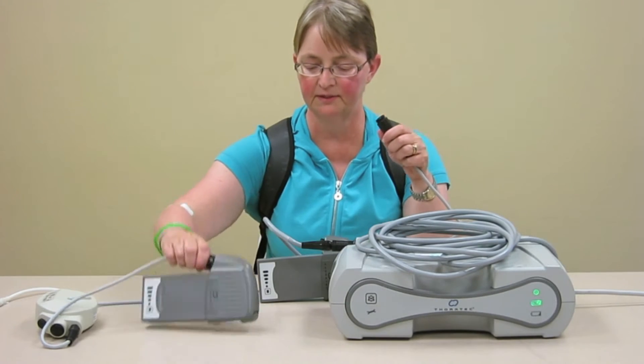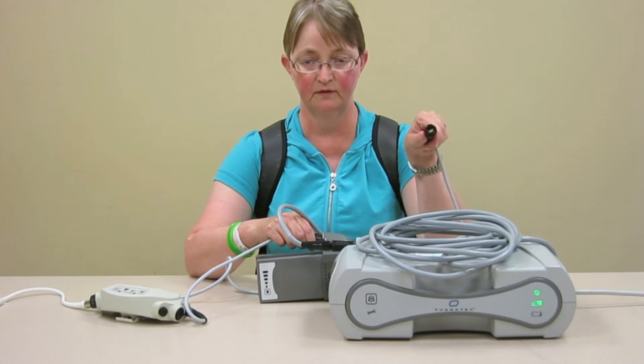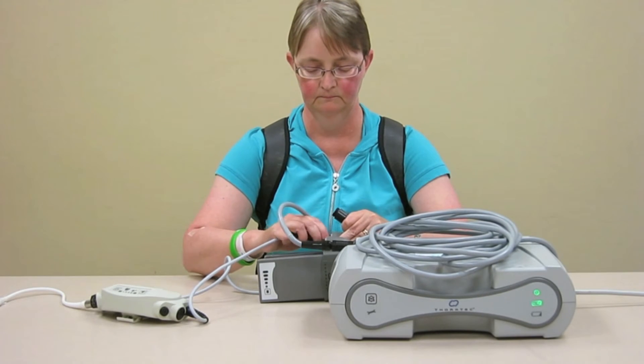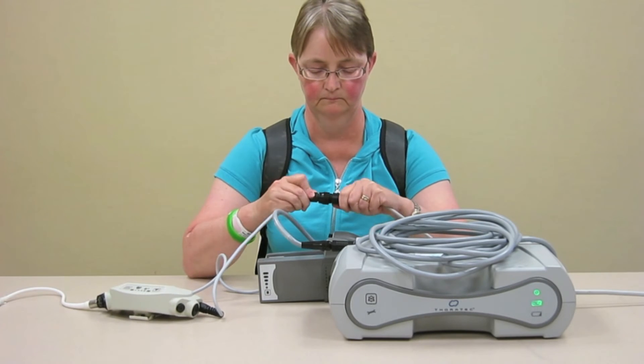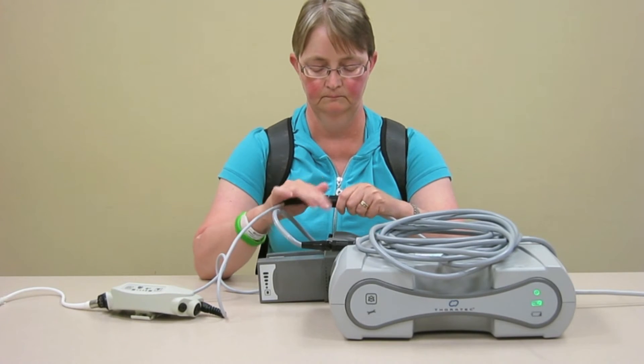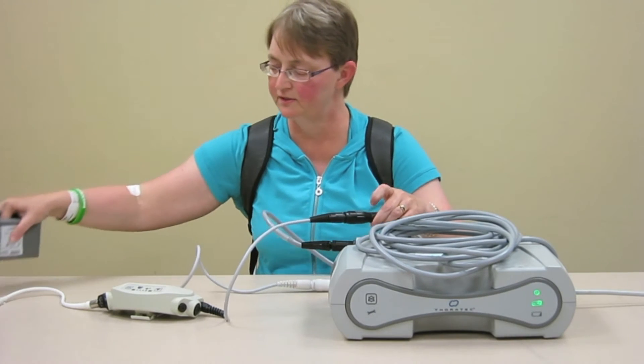We'll do the black one exactly the same way. Make sure that we've got the half circle lined up, and there you go. Battery to the side.